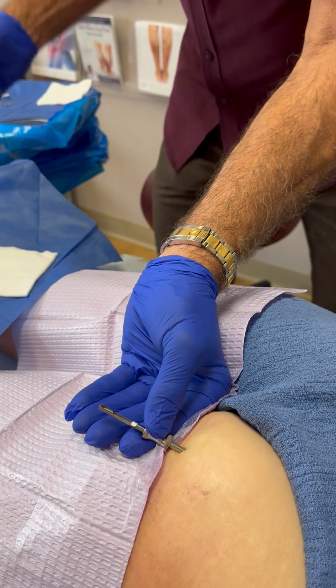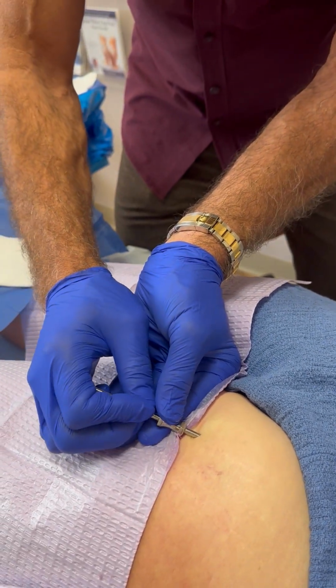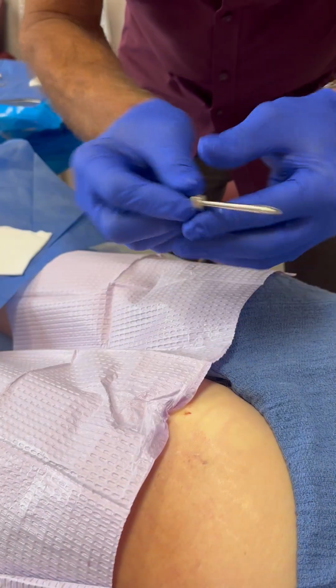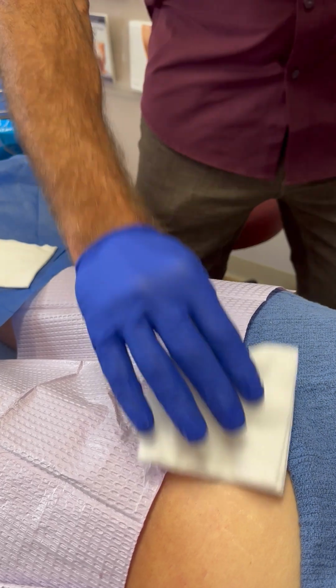And I have another trocar that's flat-ended, and I put it in. And I kind of just push a little further so it's getting down in her tissues. I'll hold my hand here so the pellet does not extrude. I can always check it to make sure it's in there. And it is. And that is a pellet insertion. It takes about a minute.